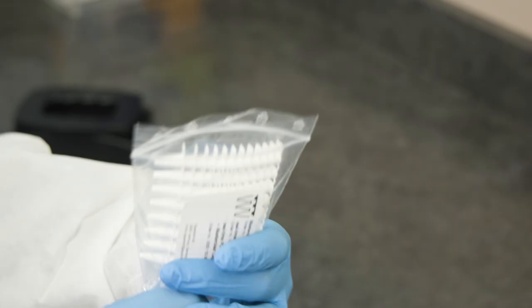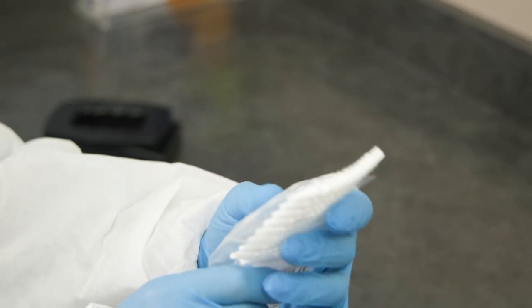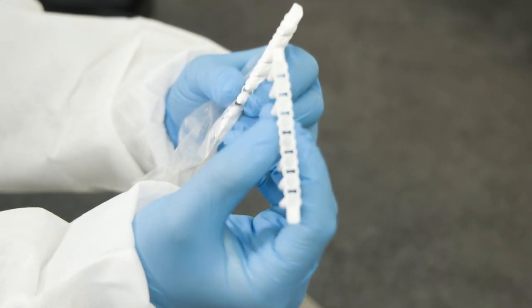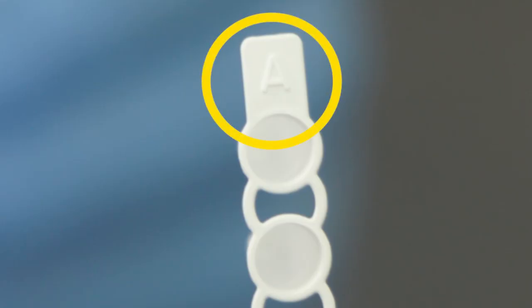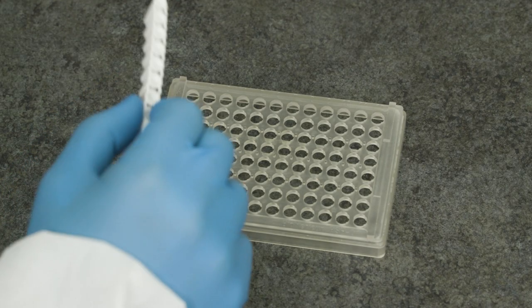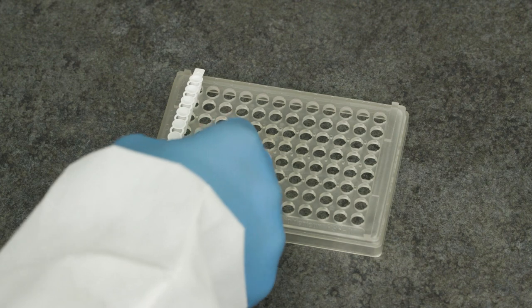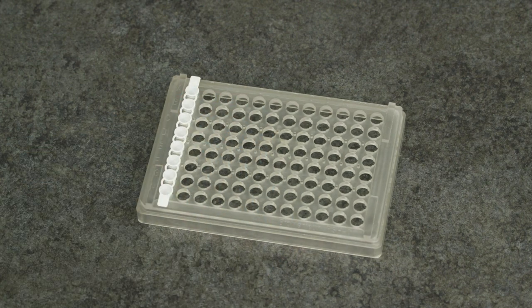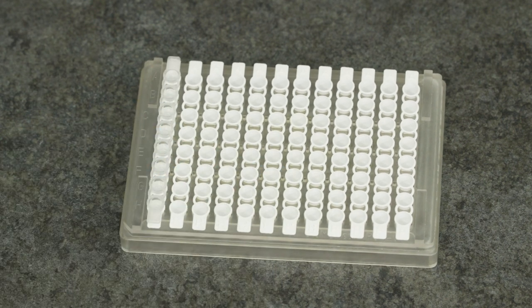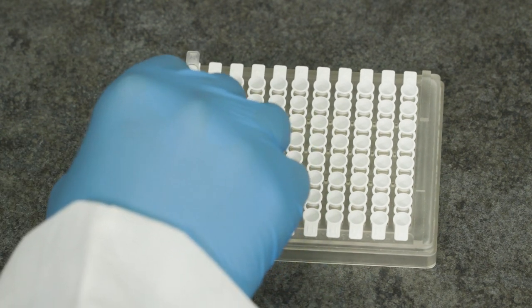Wearing powder-free nitrile gloves, remove the tubes from the bag by pushing the tubes out. Note the orientation tabs on both the tubes and the caps. Place all the tubes with the A side orientation tab in the A row. Place the caps so the A tabs of the tubes are under the A tabs of the optical caps.